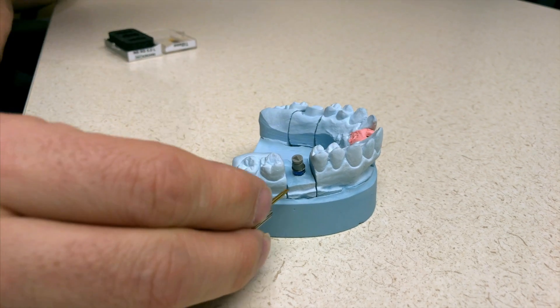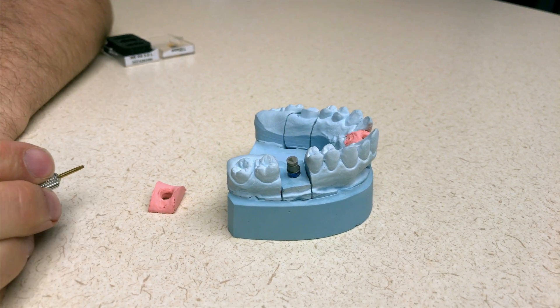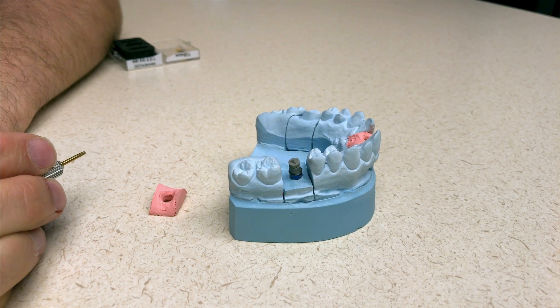We're going to make sure that it's fully seated, and it looks like it's good to go. Now let's go ahead and take it back to the Omnicam scanner and scan it.